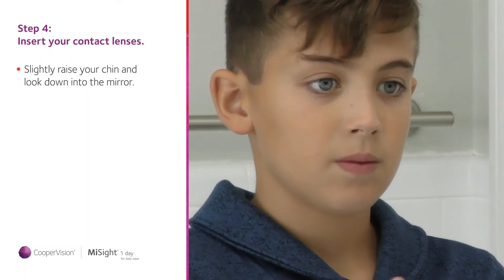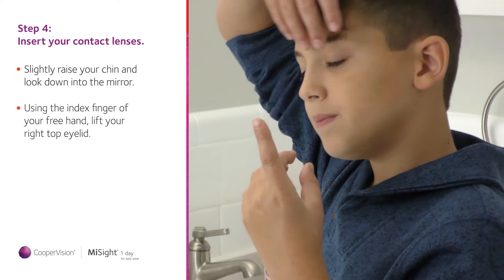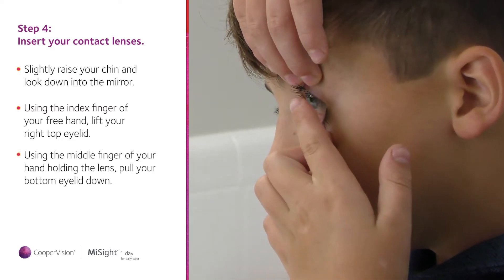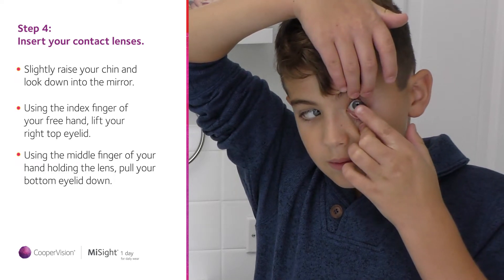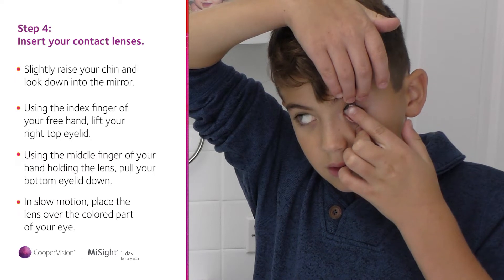Slightly raise your chin so that you are looking down into the mirror. Using the index finger of your free hand, lift your right top eyelid by holding where your eyelashes meet your eyelid. Using the middle finger of your hand holding the lens, pull your bottom eyelid down. To test that you have a firm hold, blink. Only your left eyelid should move.